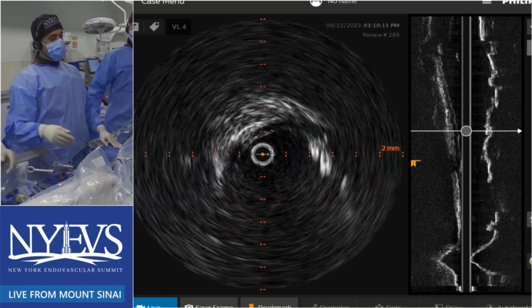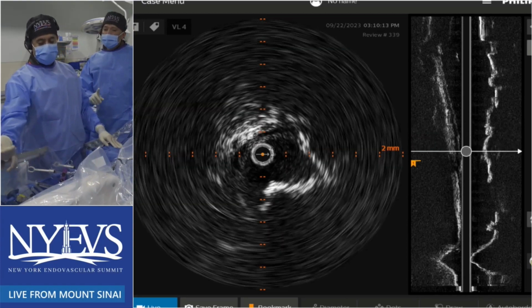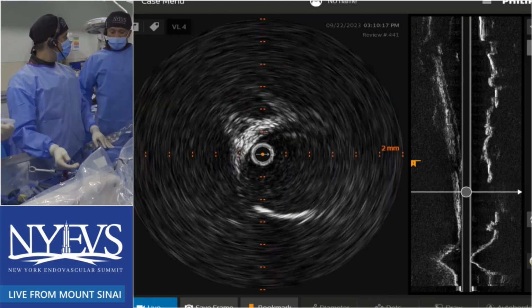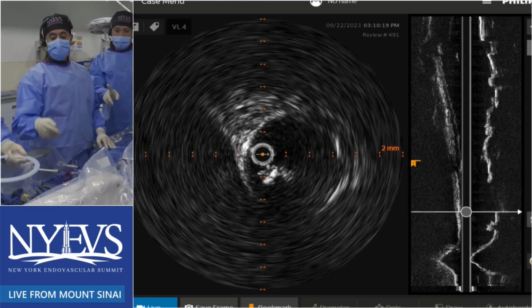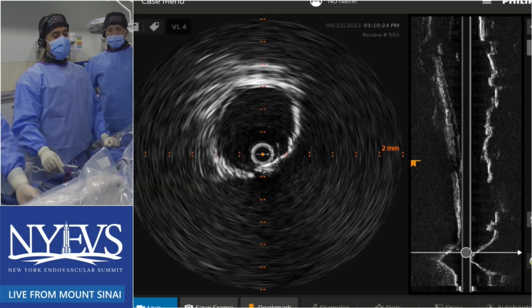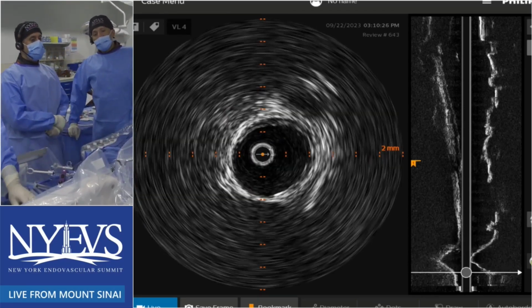Because balloon expandable? This is a TASC A lesion. This is really short, and the real issue is whether covered or uncovered. The issue is, are you going to get adequate expansion? And I would just use an uncovered stent here. So I have a question for the panel, and I mean everybody's talking A, B, C, and D, right?